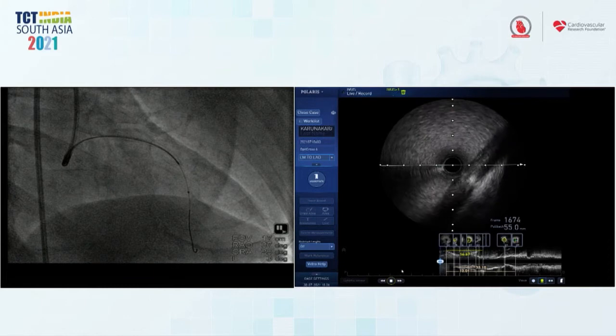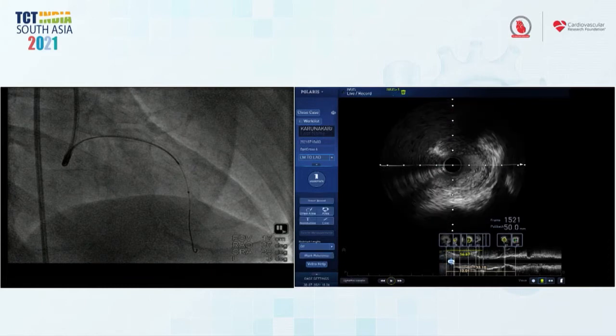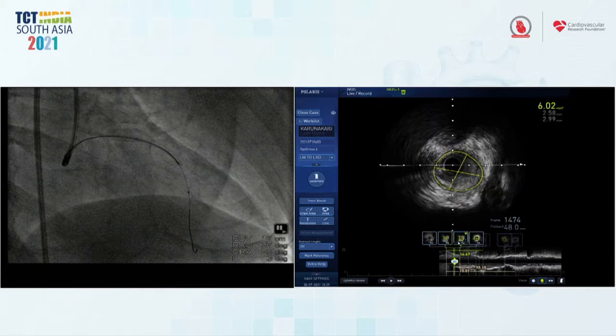So there's clearly what appears to be a modestly negatively remodeled, heavily fibrotic vessel. Just show the measurements here, please. This is the lumen area. Just go distally. The left main size close to the ostium was only 2.75, and distally it expands to close to 3.5. Significant negative remodeling close to the ostium. There doesn't appear to be any calcium in the lesion; it appears to be a soft plaque. Most probably this is the cause for the syncope.